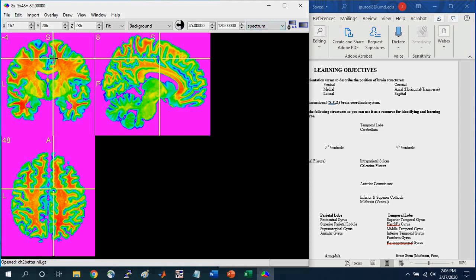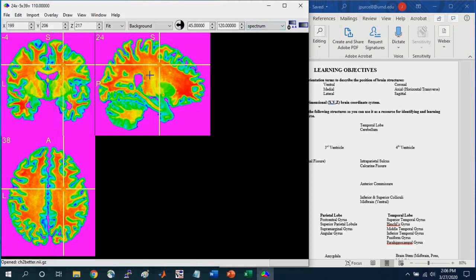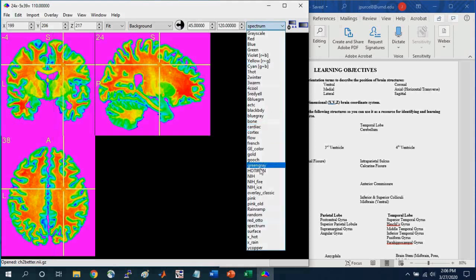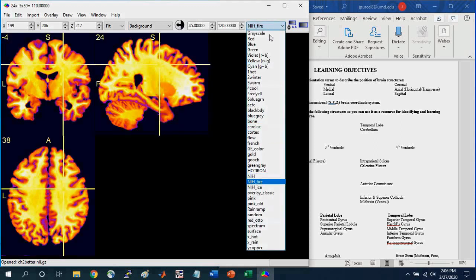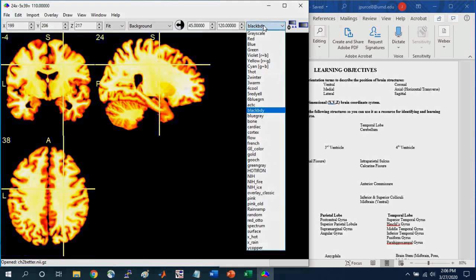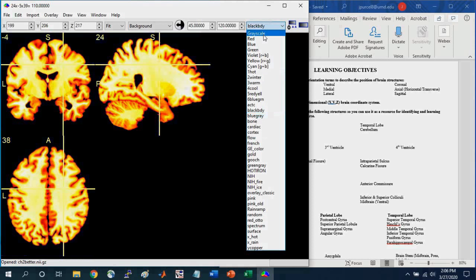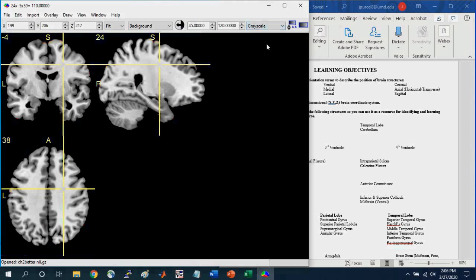And so we can see that we're now assigning different colors for the different intensity values. So now the lower values are in the green and the blue, and the higher values are up into the orange and the red. And so you can select different options for the color scales to kind of play around a little bit. But for the most part, we'll keep with the grayscale.